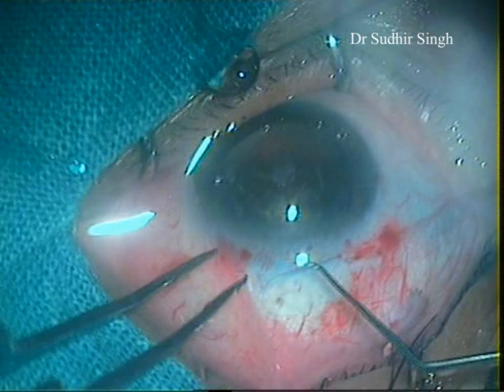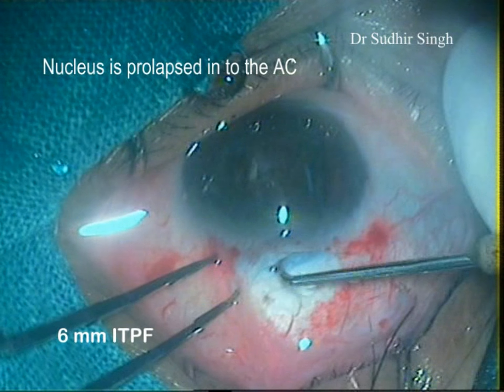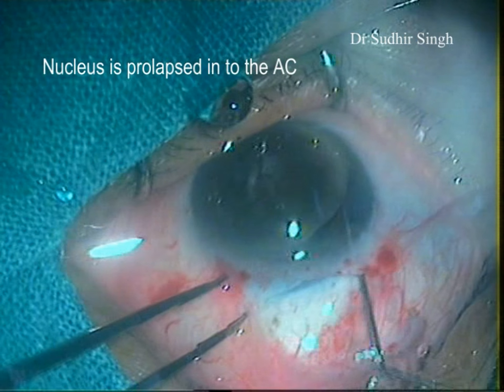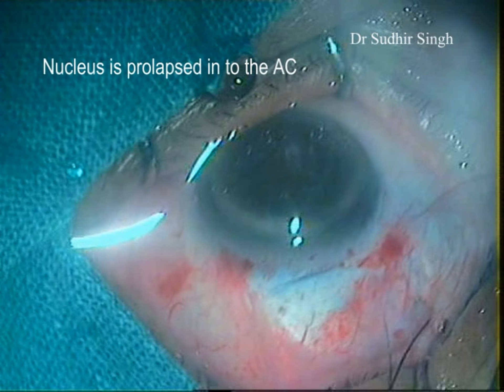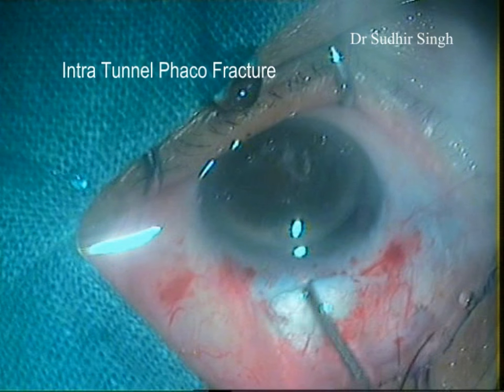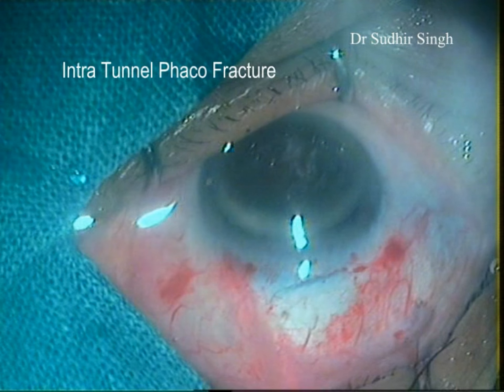The nucleus is prolapsed into the anterior chamber with the Sinsky's hook. Enough viscoelastics is placed between the cornea and the superior surface of the nucleus, and between the inferior surface of the nucleus and the iris. The vectus is introduced through the tunnel and positioned between the iris and the nucleus. The nucleus is engaged in the lens loop and slowly withdrawn from the anterior chamber while the posterior lip of the tunnel is depressed.